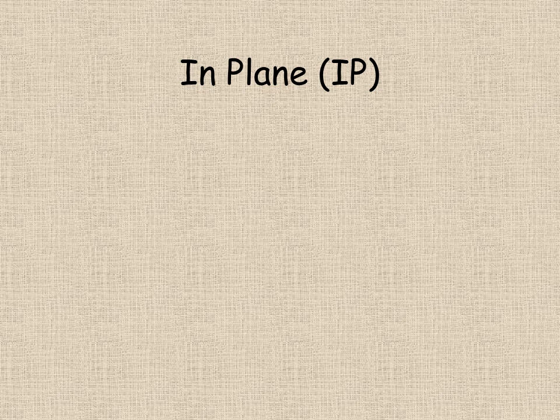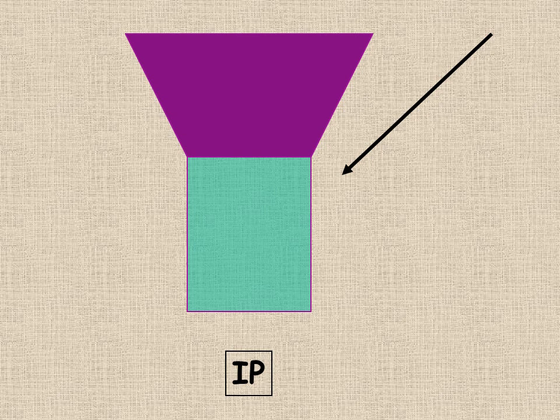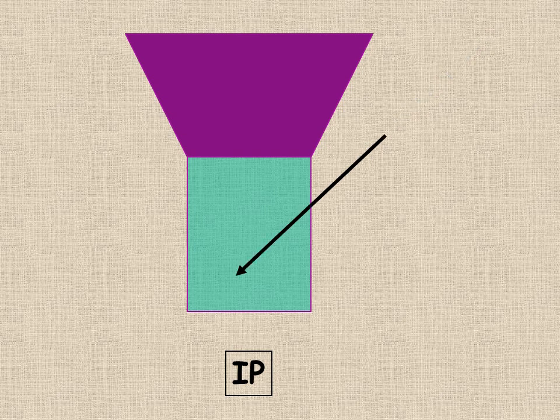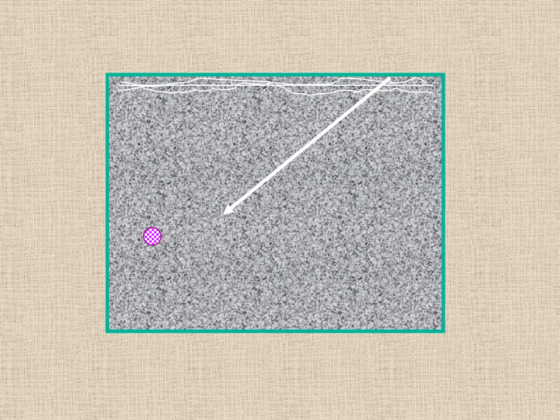For in-plane approaches, it's much easier to see in picture. So here we have the whole length of the needle and the tip.